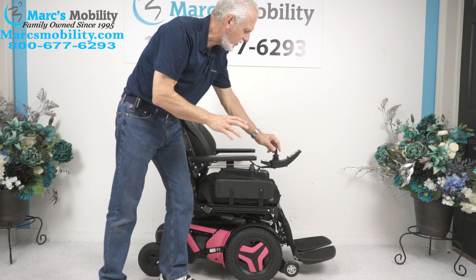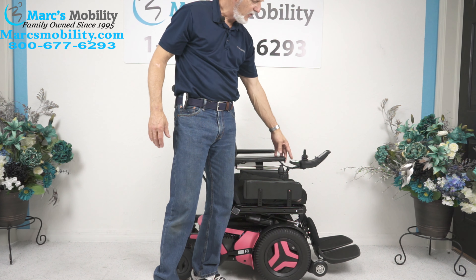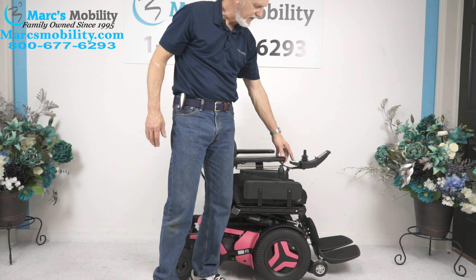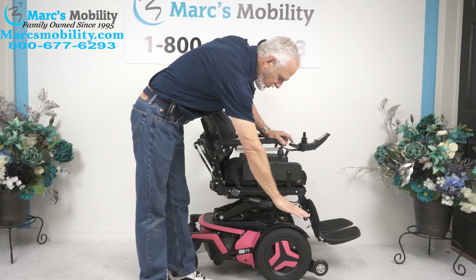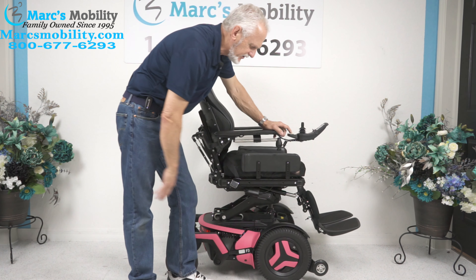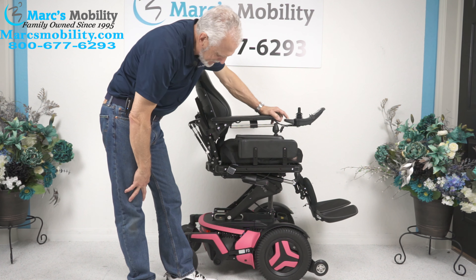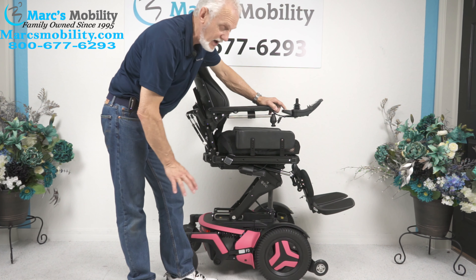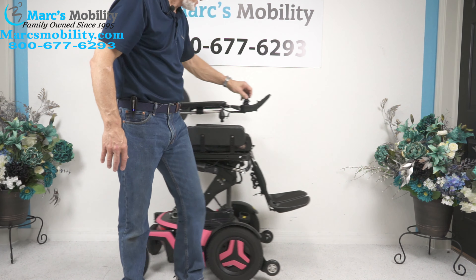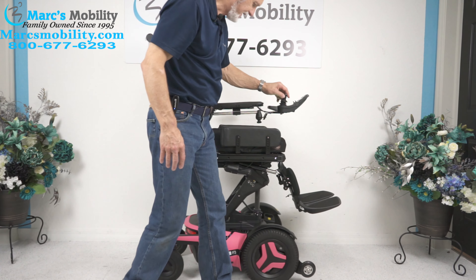It has four electrical functions. All the functions can be worked through the joystick or through the switch box. I like to use the switch box. The first button on the switch box is the seat lift. If you press on it, the seat will start going up. You'll start roughly at 22 inches and by the time it's all the way up, you'll be at 34 inches — the seat goes up 12 inches. The nice thing about these power chairs is that once the seat is elevated, it'll still drive at a decent speed. Right now the seat is elevated and it still moves pretty good. That's the seat elevator right there.